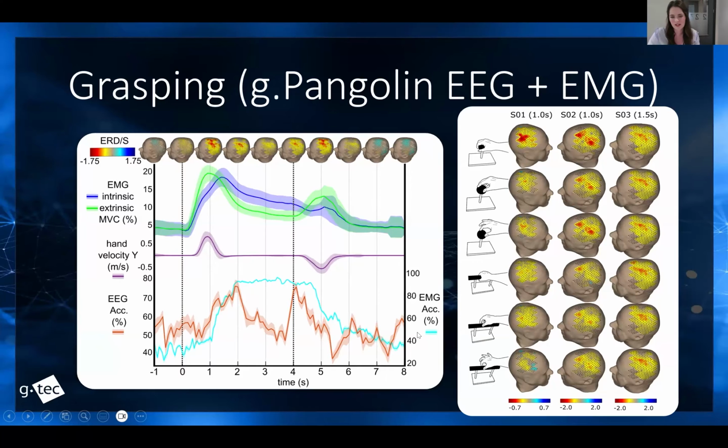For EMG we have a 3-class problem, so we classified all 3 movements within one object, and the axes are on the right. Again, you see it starts around chance level, but once the movement starts, as you can see in the other modalities, the accuracy increases to around 95%. And in contrast to EEG, it stays there until the end of the trial, and then the accuracy drops.